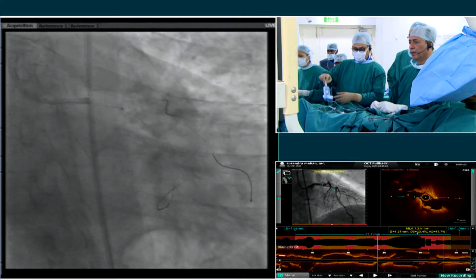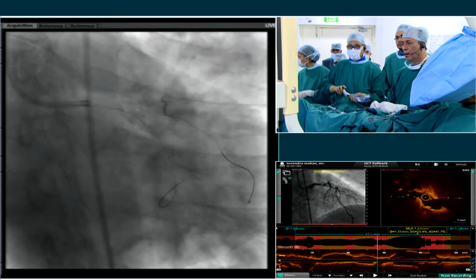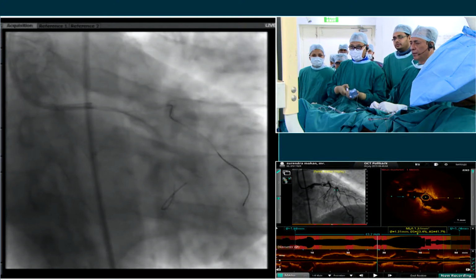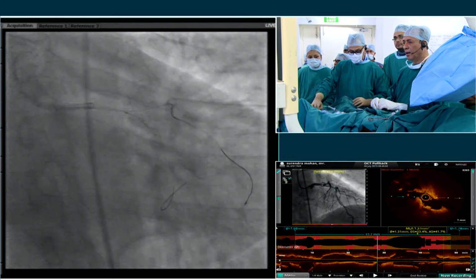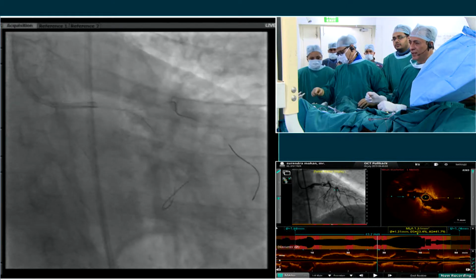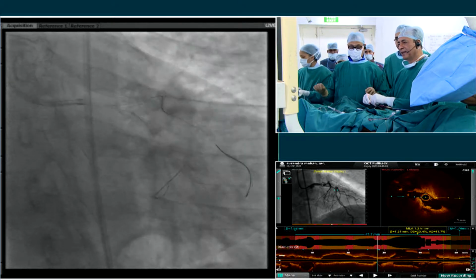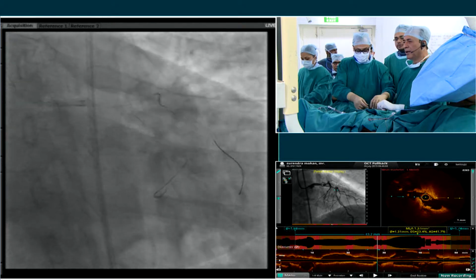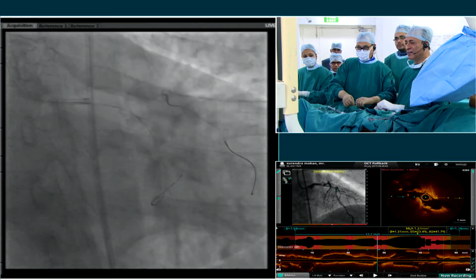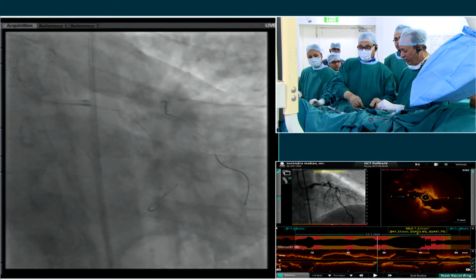The one thing about the Whisper that's great is that it crosses well, but in these long cases, especially with exchanges in and out, you do have to watch your distal wire position to be sure that you don't have a distal wire perforation that can occur, and that's often why we will swap out. That is one of the worries. Many of these hydrophilic wires are notorious for that, and just take it out. And you can see the tip of the wire, at least here, turned around is better, more safe, I think.